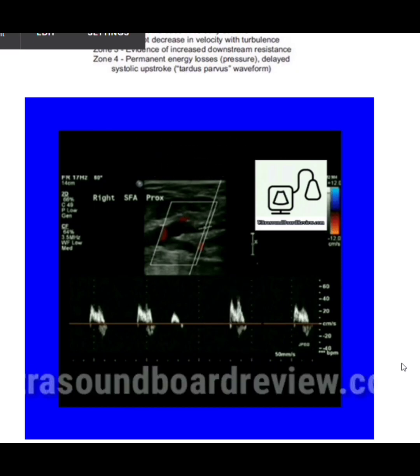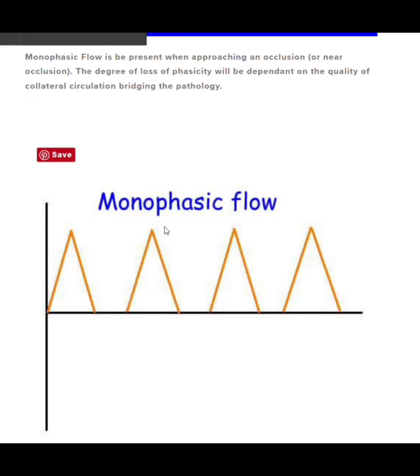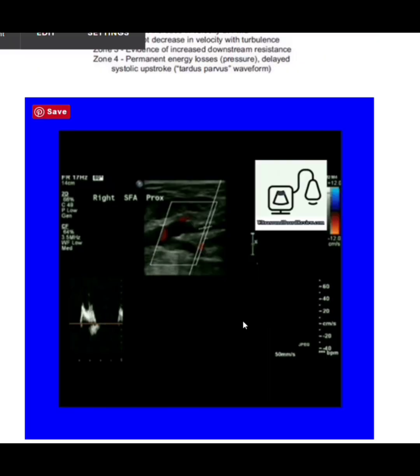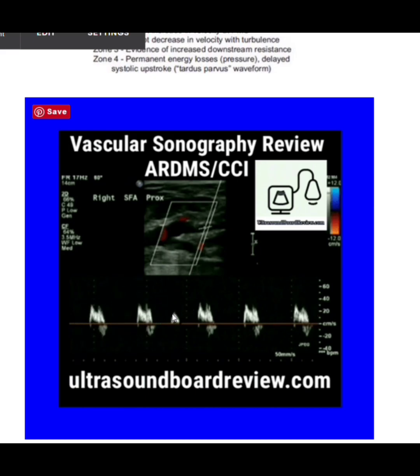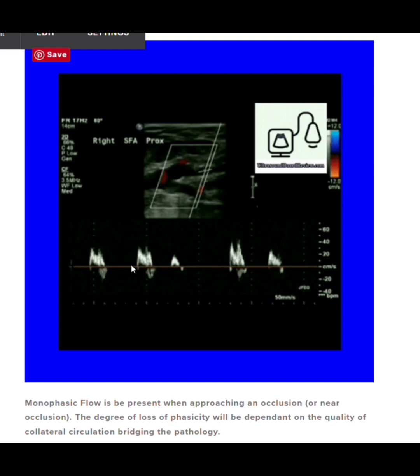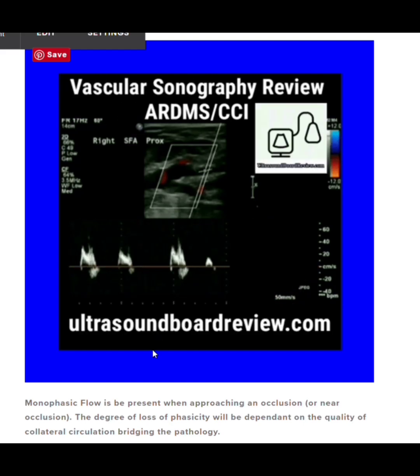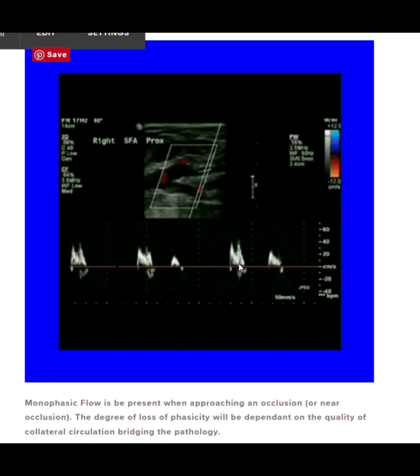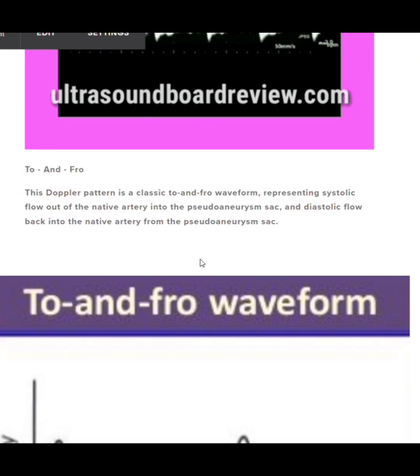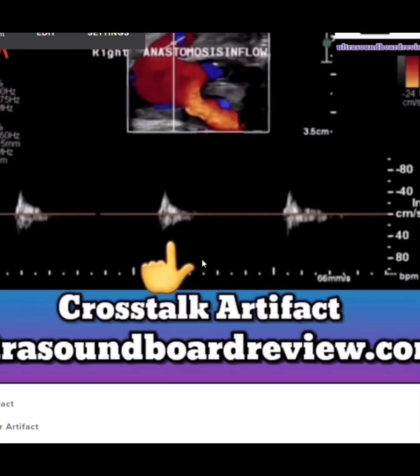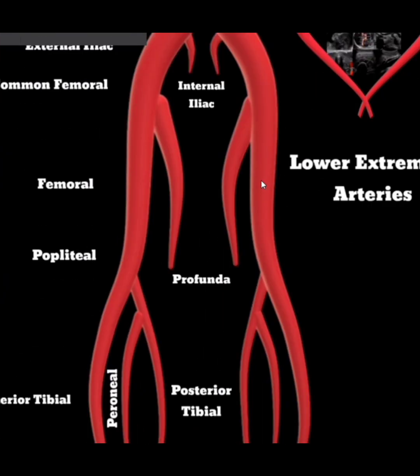This waveform is characterized as low velocity, high resistance flow, with a slow upstroke and slow downslope. We know it's low velocity by comparing to the scale, and high resistance because there's no flow in diastole. This is also referred to as monophasic flow and is problematic — if you see this waveform in an artery, it means the disease or occlusion is downstream from where you're scanning, and you are upstream from the disease.